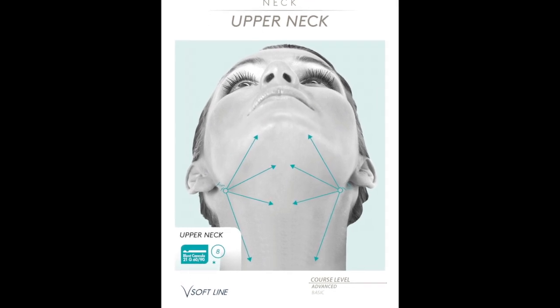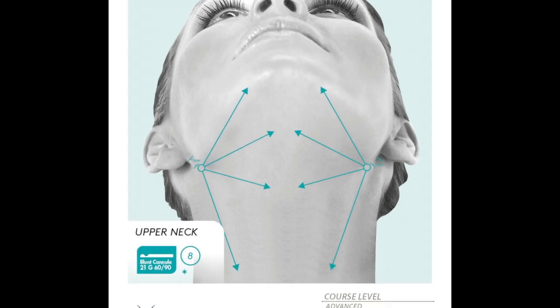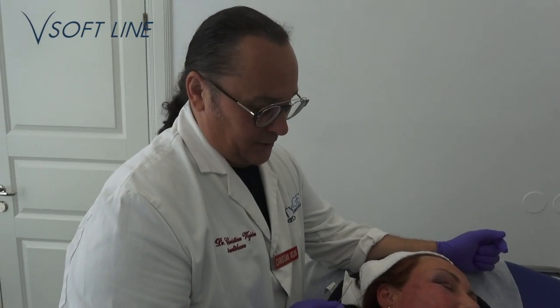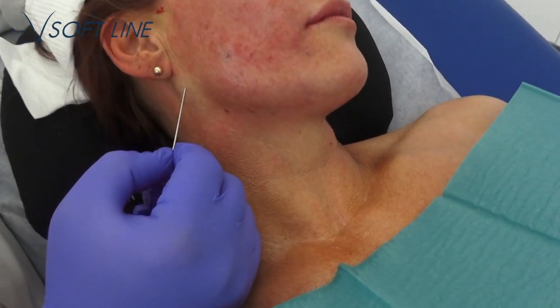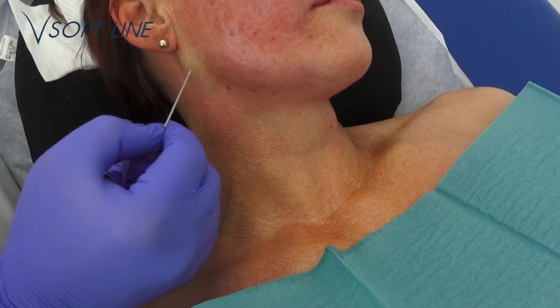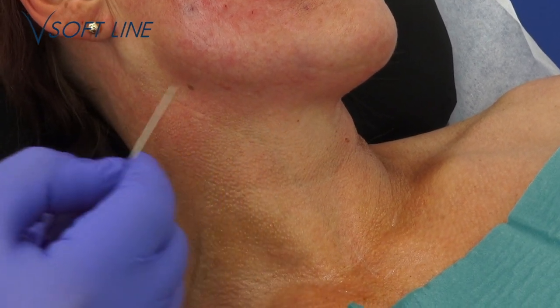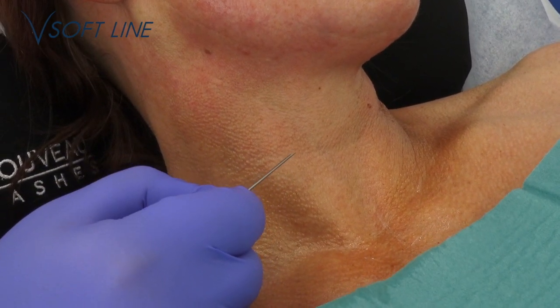Neck. Use 8 V SoftLine barb blunt cannula L or sharp 21G 60mm or 90mm, depending on the patient. Now we are ready to proceed to the neck. I draw a line in parallel with the jawline, right here, one just below the jawline, and one in the triangle fold here, which runs roughly here, and then the upper neck. How far down you wish to go depends on how much excess skin there is on the lower neck.